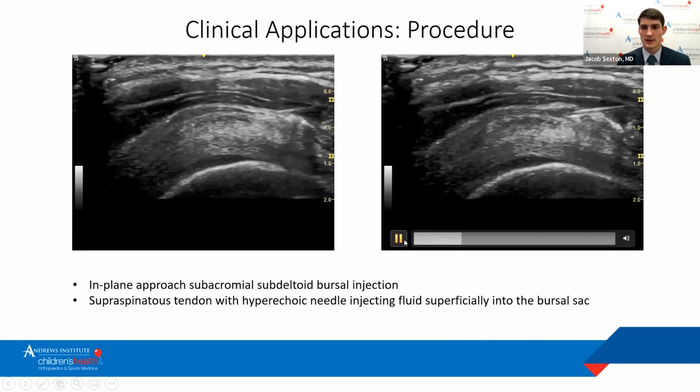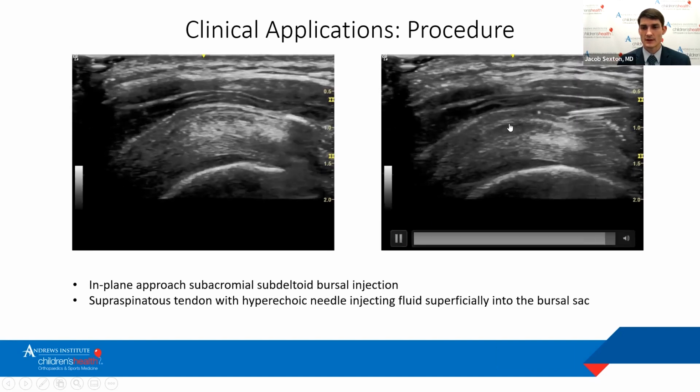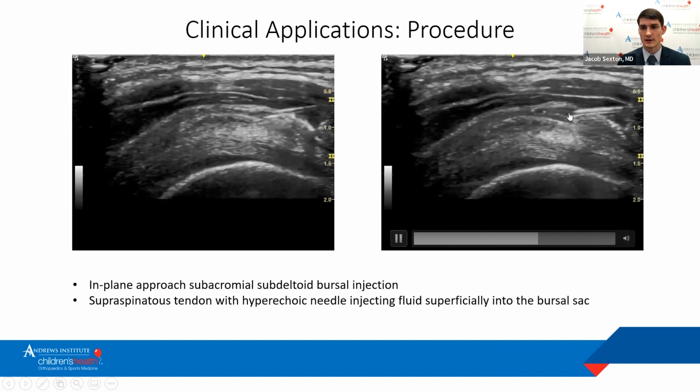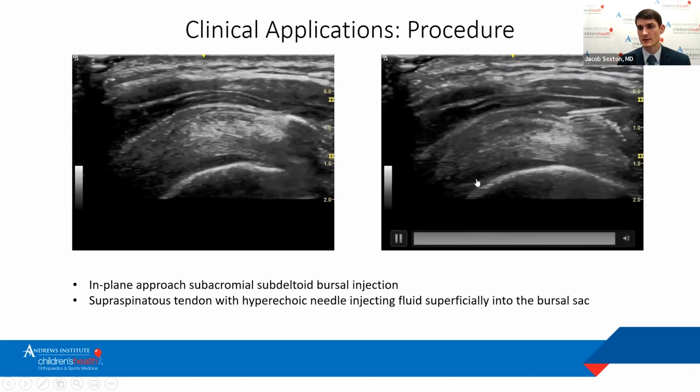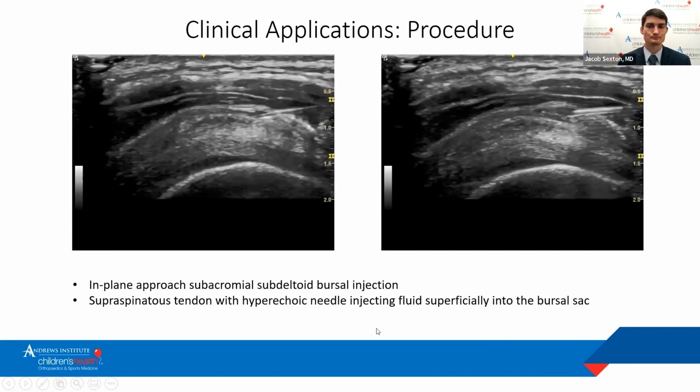So then this next image is a continuation of that. You see the filling of this bursa here opening up, and it lets me know we're in a good location. The medication's being put in appropriately.